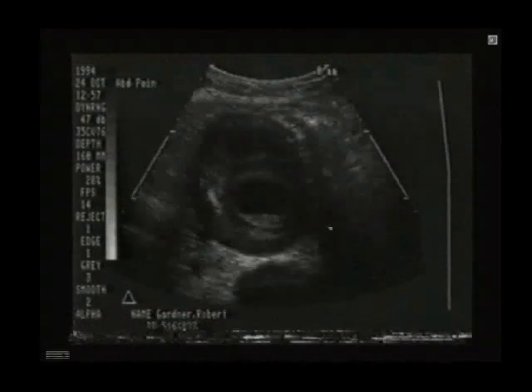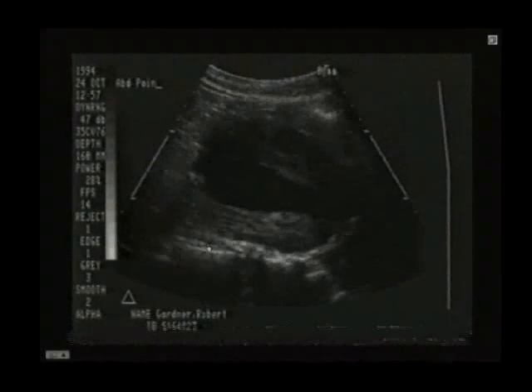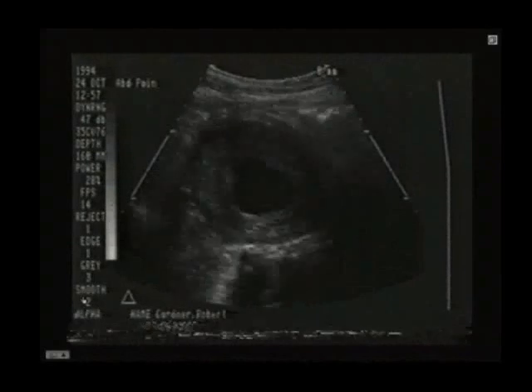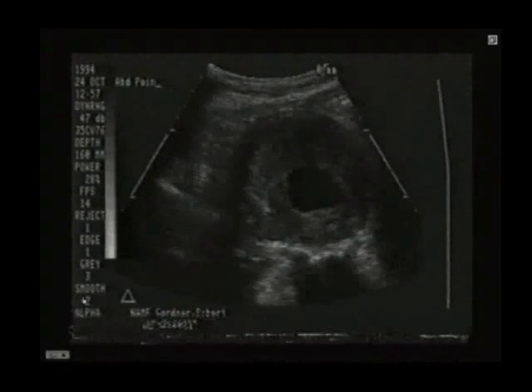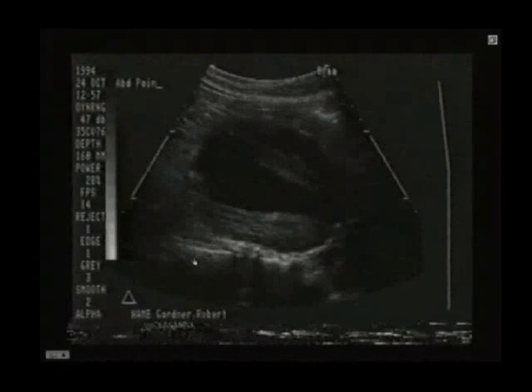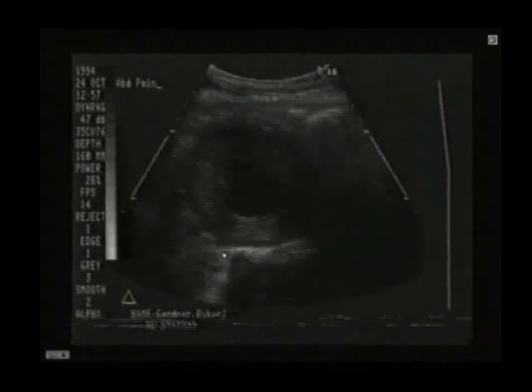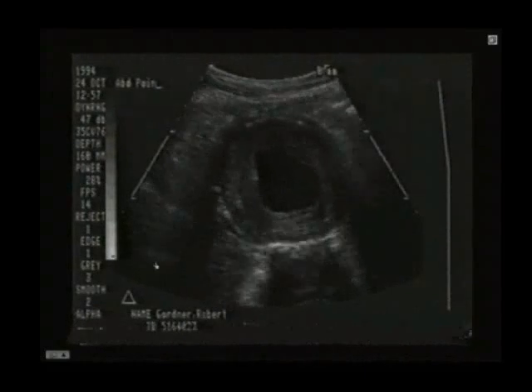There's actually a very small amount of fluid right along here. A little bit of retroperitoneal leak that you can see as well, which is obviously a problem. Now, the retroperitoneum usually is not well visualized. If you're worried about retroperitoneal leak and those sort of things, you're going to need a CT. Right. Let me show you that fluid again. Just a little trace of fluid we see right there. Okay?